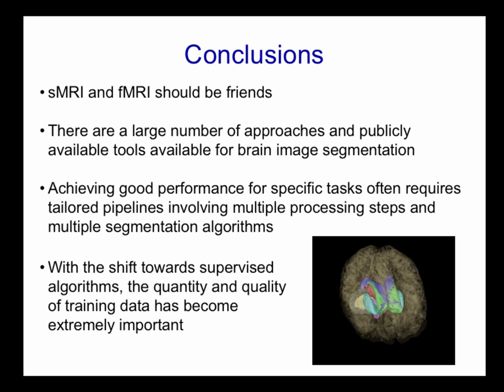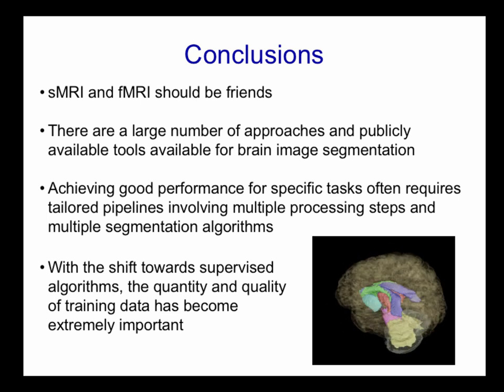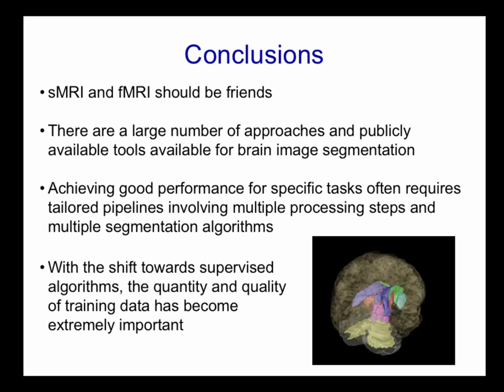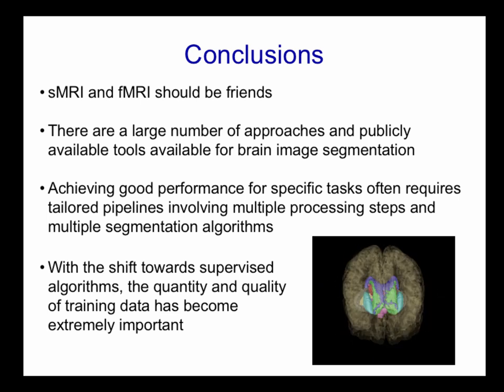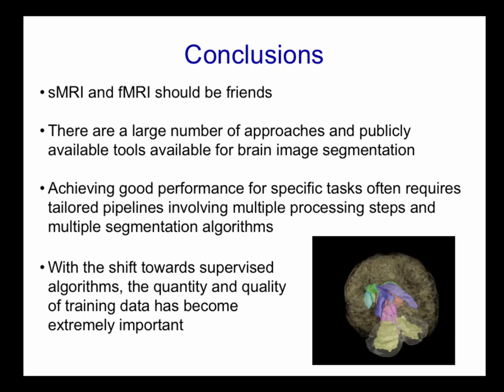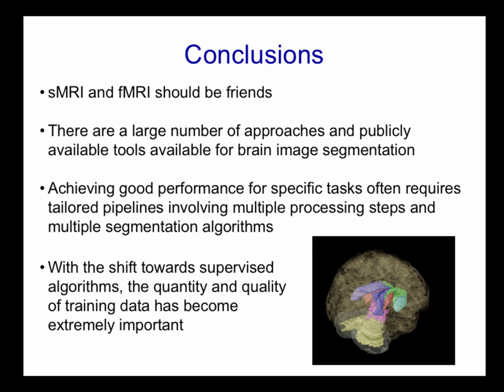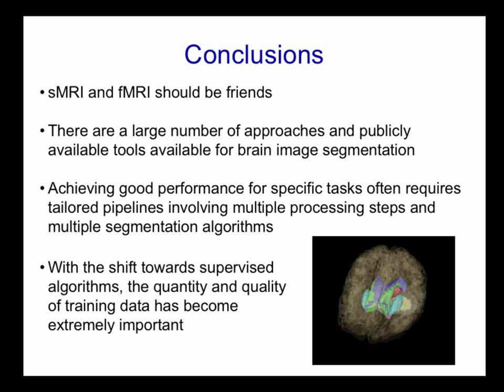Okay, so the question was, what are the differences between the atlases used in, for example, the multi-atlas label fusion? As I mentioned, training data is hard to come by. So the 30 atlases were, in this case, 30 healthy brains from the OASIS data set.